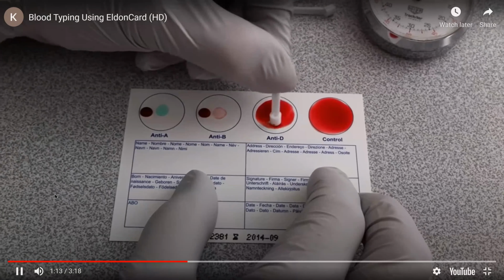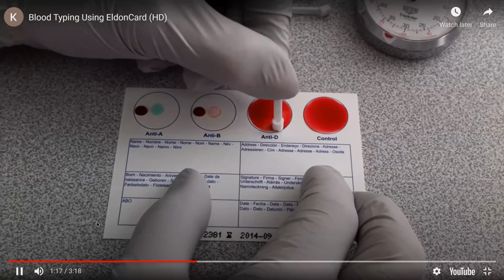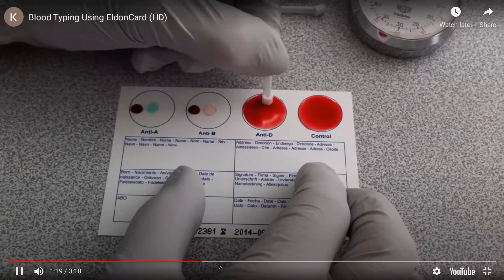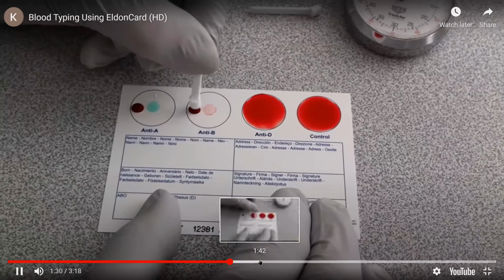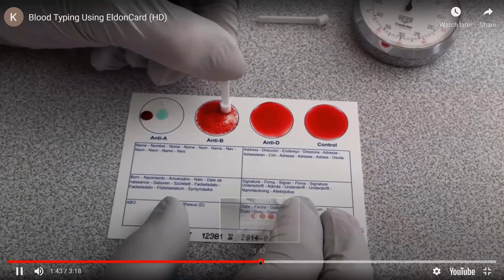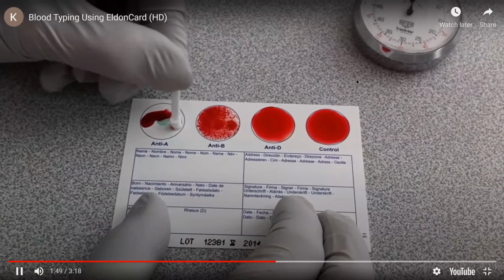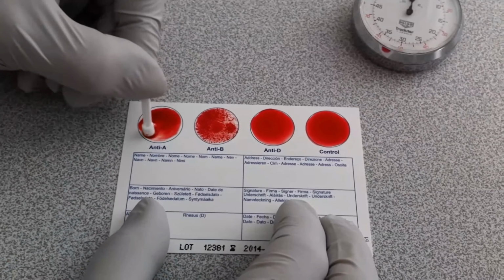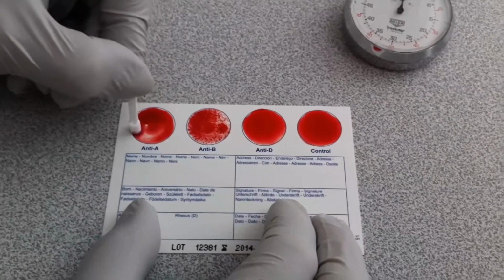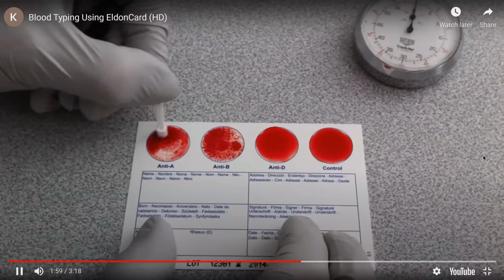Now they're mixing the anti-D in, so that's testing for the presence of the RH sugar tag. They go ahead and mix anti-B. Important to note that they are using different mixers, separate mixers for each different sample. And that's, of course, because you want to avoid cross-contamination.